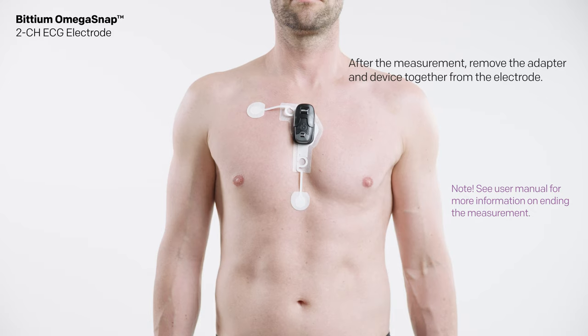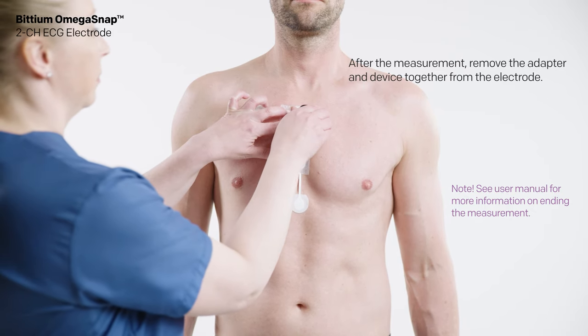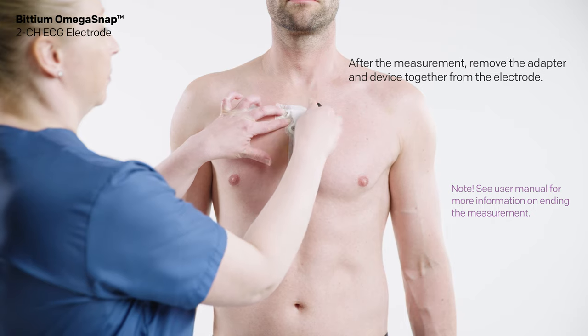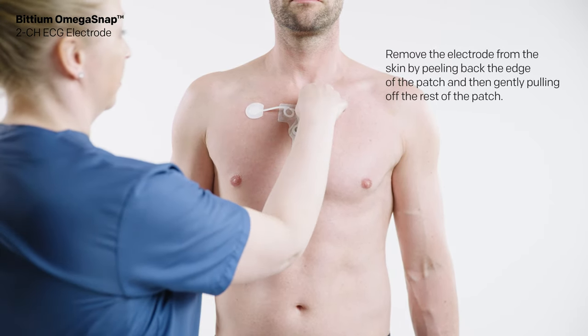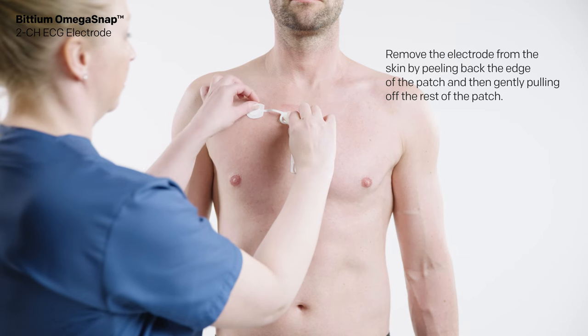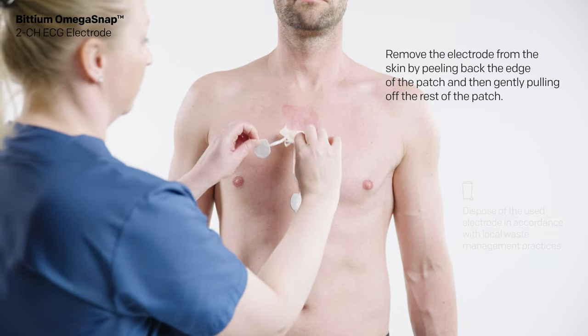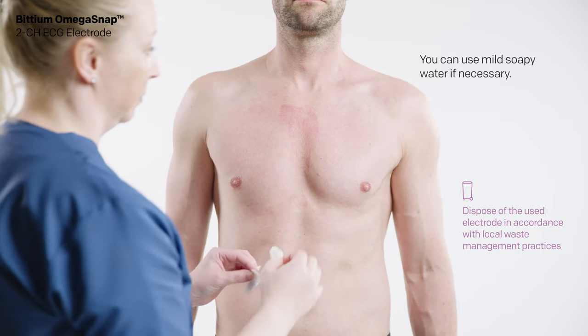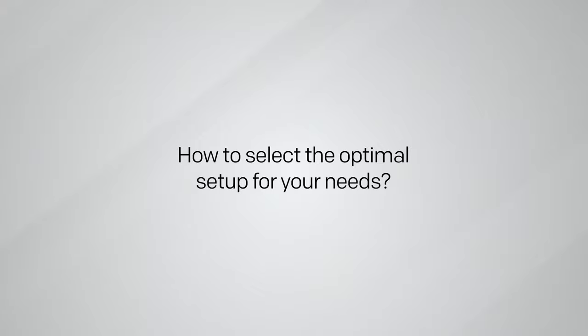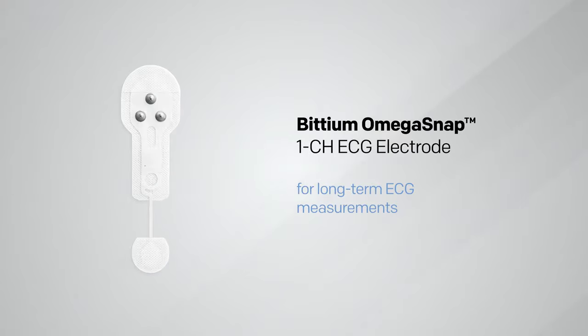After the measurement, remove the adapter and device together from the electrode. Then remove the electrode from the skin by peeling back the edge of the patch and gently pulling off the rest of the patch. You can use mild soapy water if necessary.